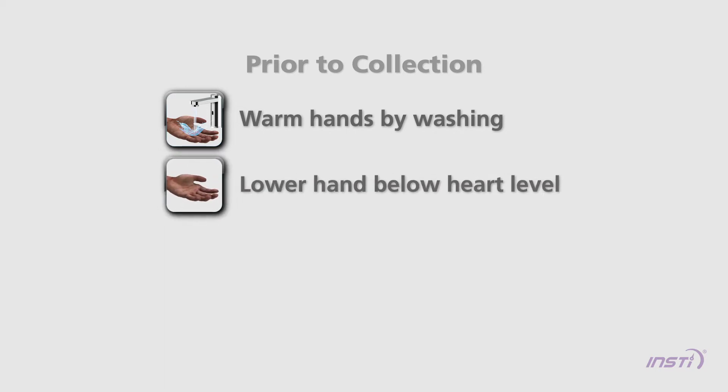Prior to collection, warm the hand by washing in warm water. Ensure the hand is fully dry. Lower the hand below heart level before collecting a drop of blood. Massage the finger with a downward motion several times before performing the finger stick.